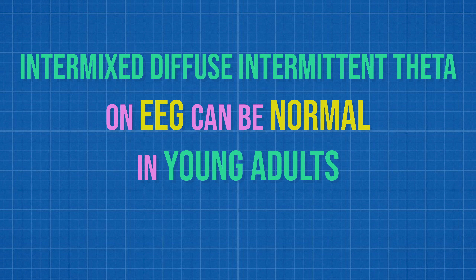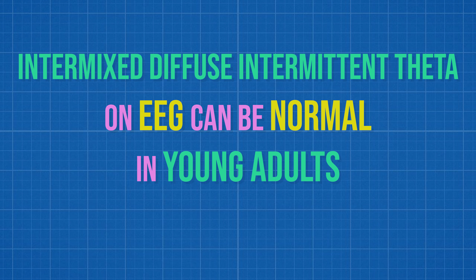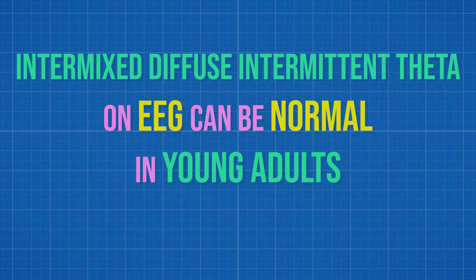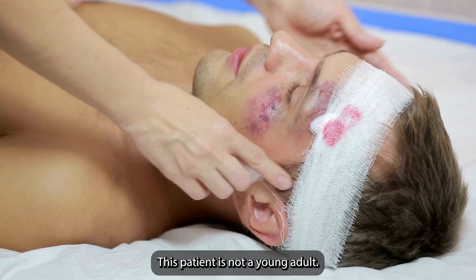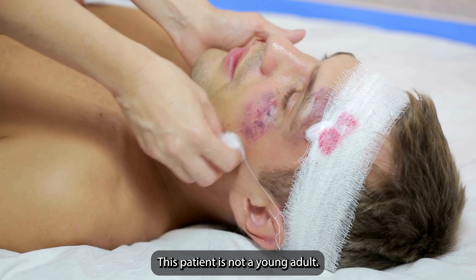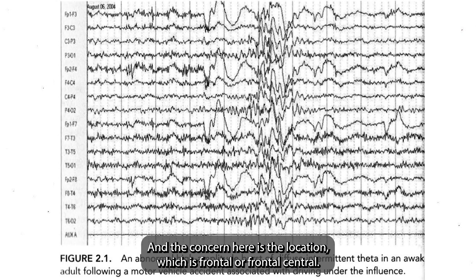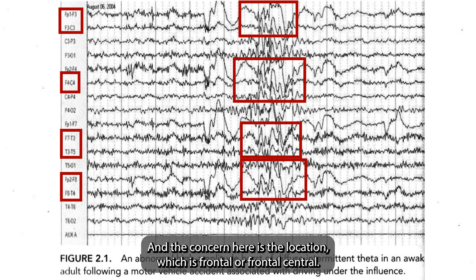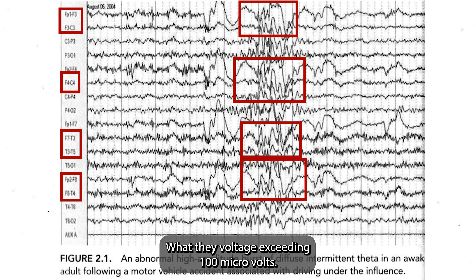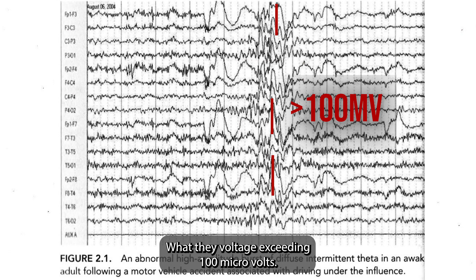Although intermixed diffuse intermittent theta on an EEG can be seen normally in young adults, this patient is not a young adult, and the concern here is the location, which is frontal or frontal-central, with a voltage exceeding 100 microvolts.